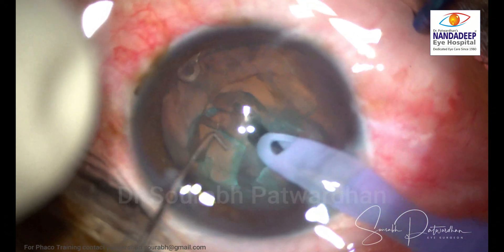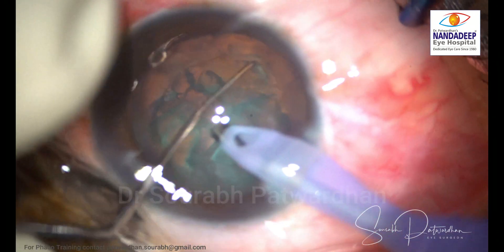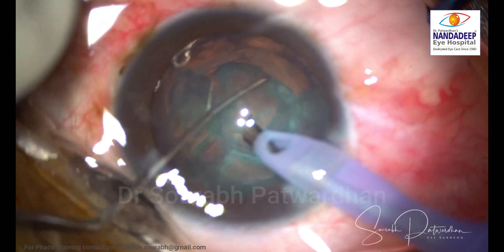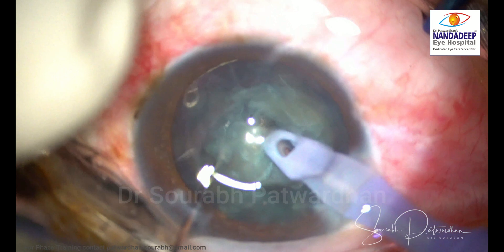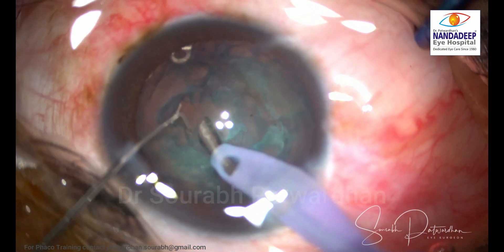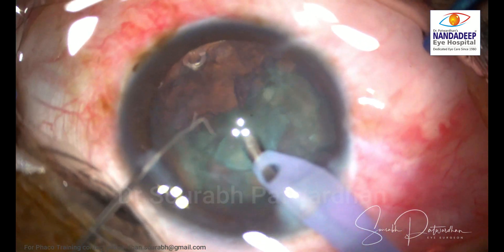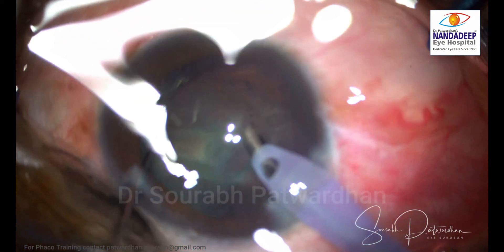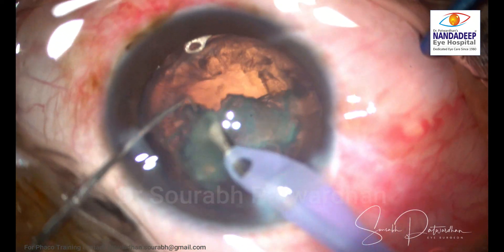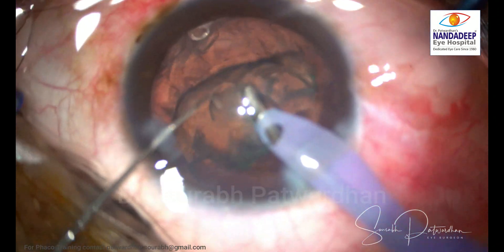Because of the good hydrodissection the nucleus is rotating well. I am using a lower bottle height and lower parameters for doing the phaco. This is a fairly soft cataract, so there is some difficulty in chopping. What I do is some mechanical chops, then a trench, and then take out one piece using vacuum out of the bag. Being a soft cataract, very little phaco energy is needed — I am just doing phaco aspiration using minimal energy and vacuum, and the nuclear matter is taken care of this way.